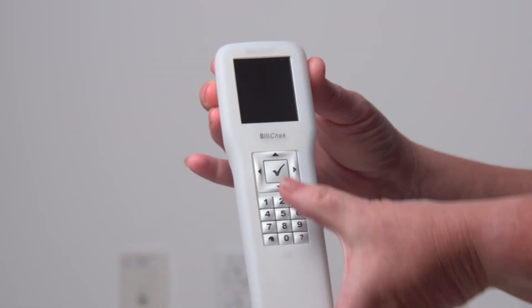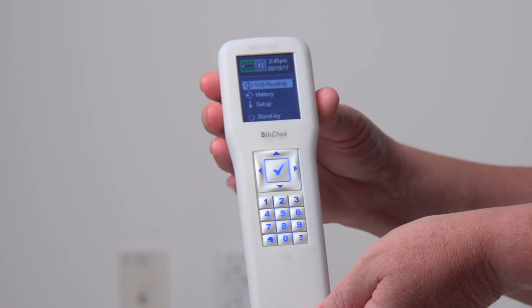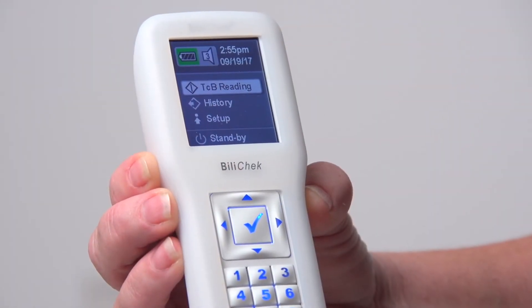To turn on the Billy Check, press the enter key. This wakes it from sleep mode. It powers up and then displays the home screen.